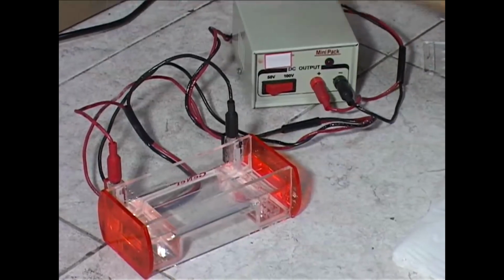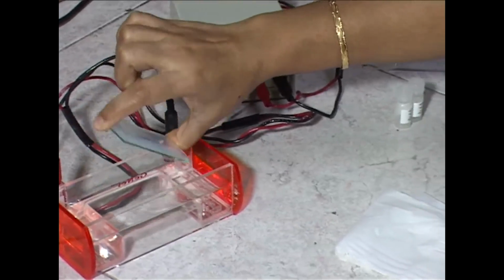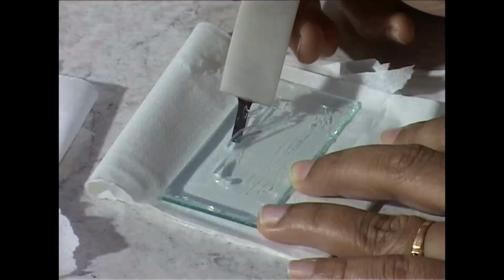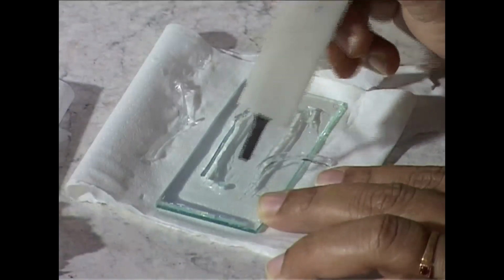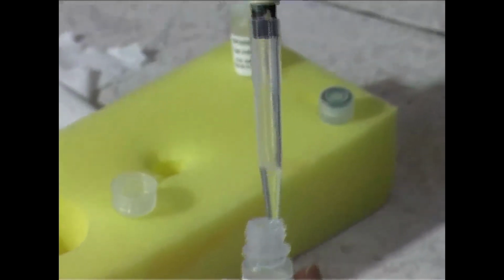Once the electrophoresis is over, we will take out the glass slide containing the gel and keep it there for 15 minutes. Then we have to remove gel from both the troughs. We have to make troughs on both sides of the well. Now we need to add the specific antiserum in the troughs.